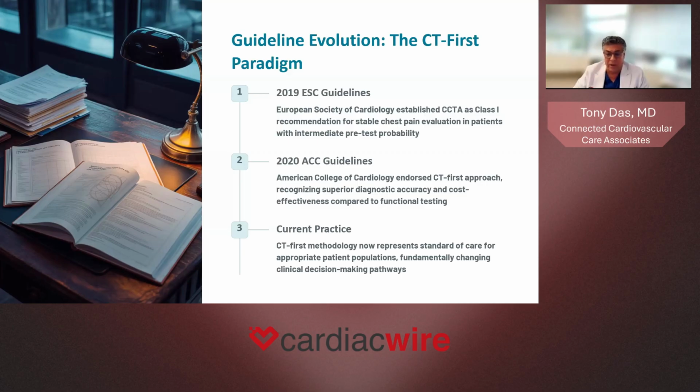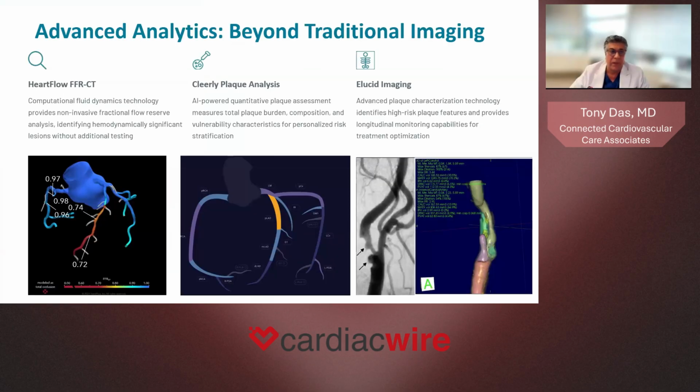And our current practice now is when we have a patient that we want to understand both anatomy and physiology and remain non-invasive or minimally invasive, we want to do this CT first program. So you can see how the adoption has actually followed the access for these high quality scanners, and now the guidelines actually suggest this is the way to go. In addition to that, we have not only the anatomic considerations, but we now have physiologic considerations that are given to us through these imaging tools.